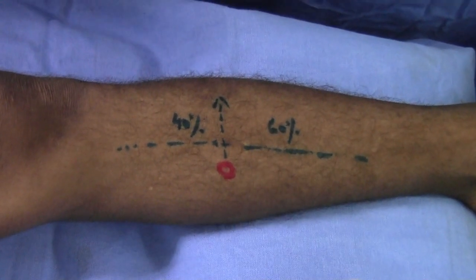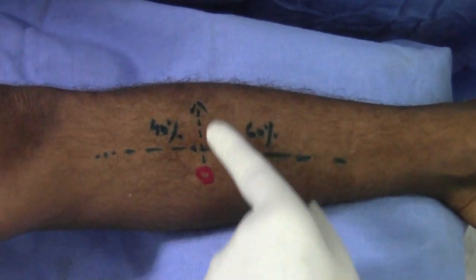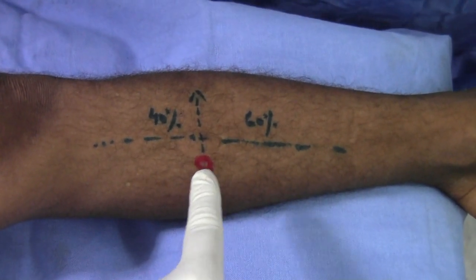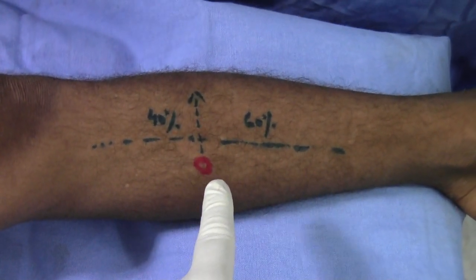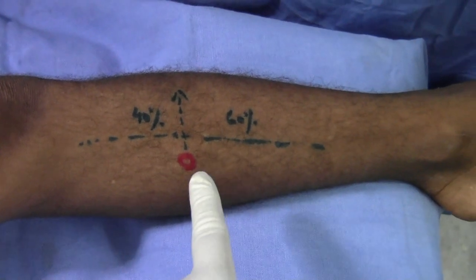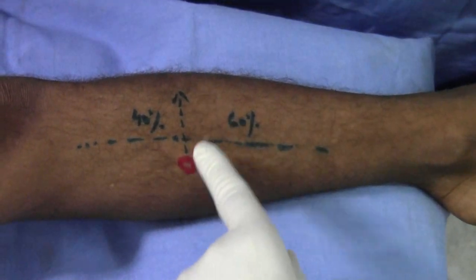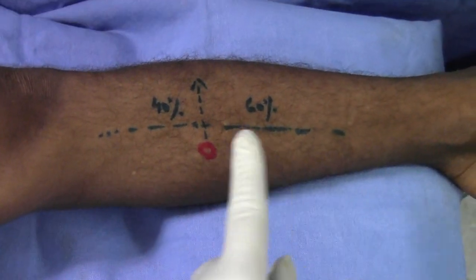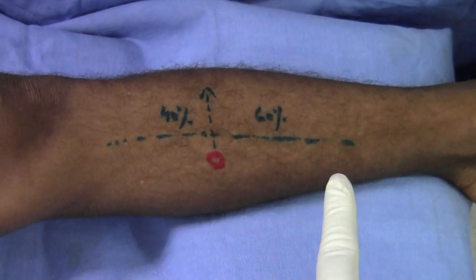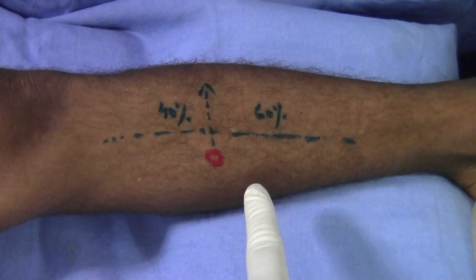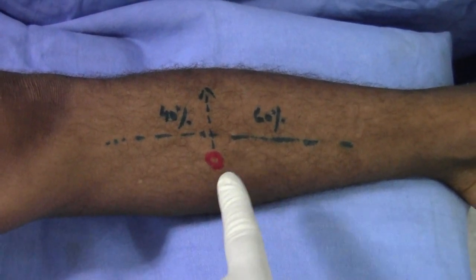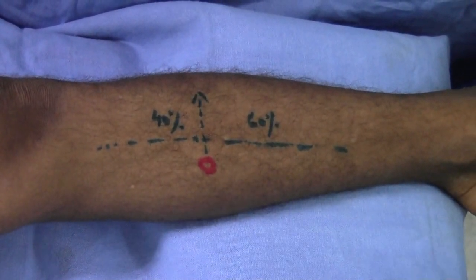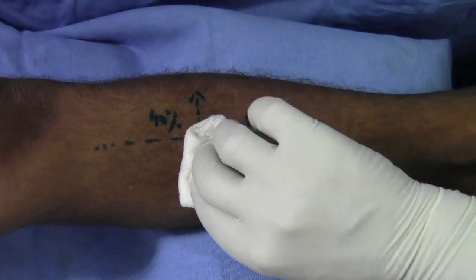I have put a dotted line here. After giving the mid-leg tibial nerve block, I will inject subcutaneously in this direction to knock out the saphenous nerve. So with the same prick, we will block the tibial nerve in the middle of the leg and at the same time block the saphenous nerve — the entry point has just been cleaned.